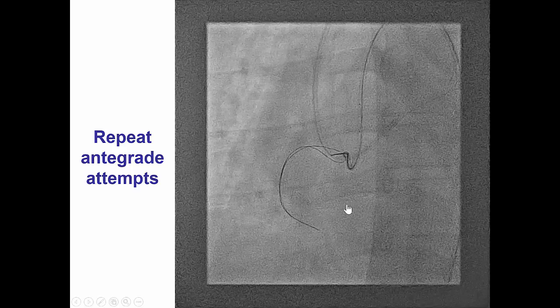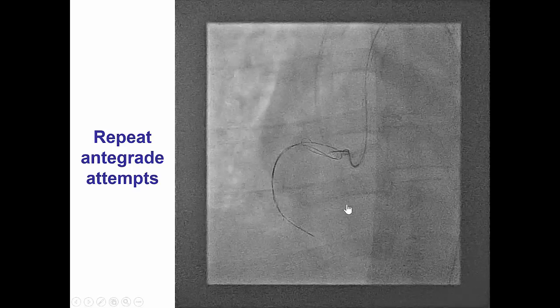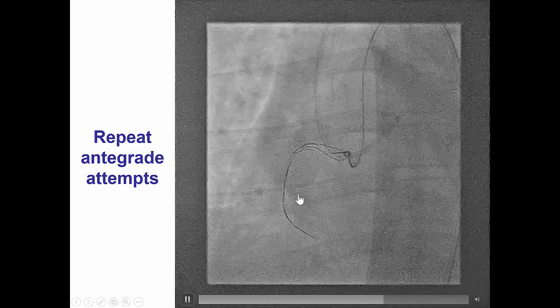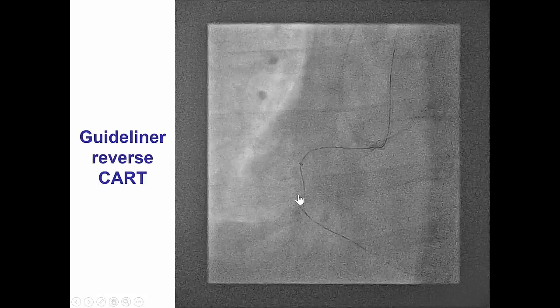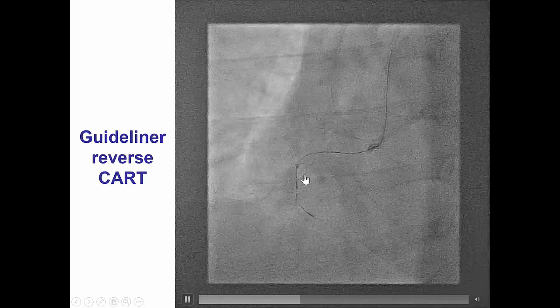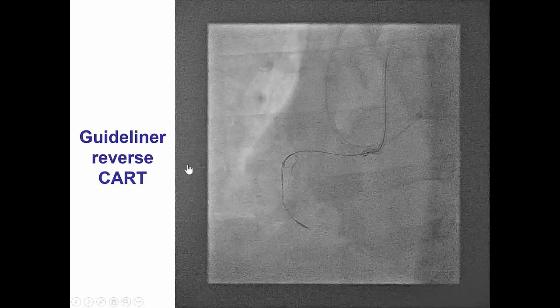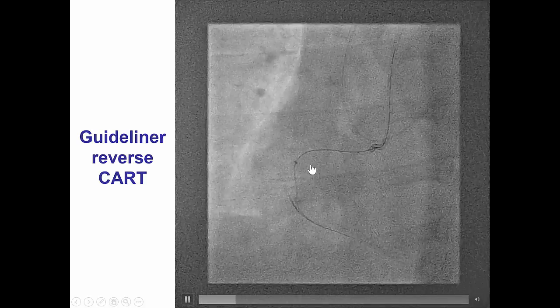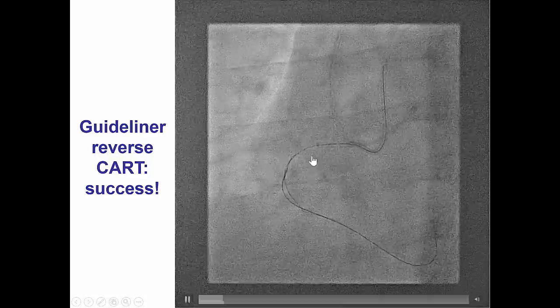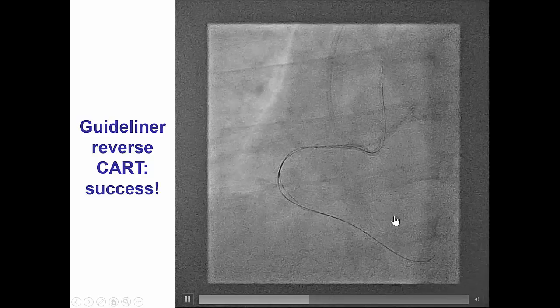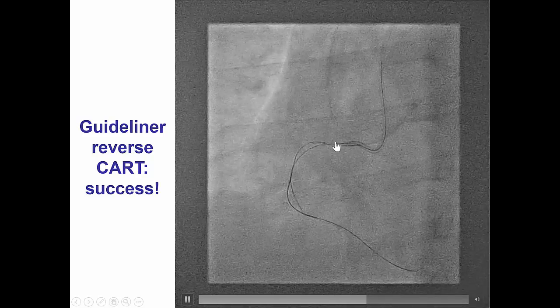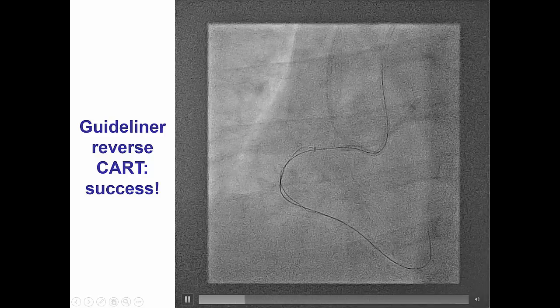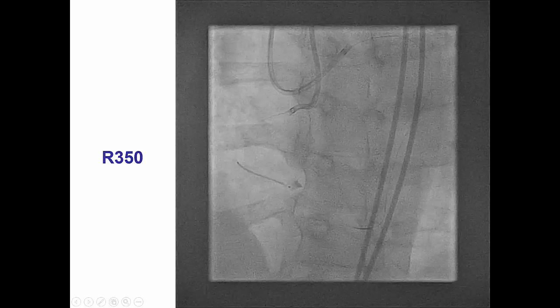We made multiple antegrade attempts to get a wire into the dissection plane, and eventually we were able to advance an antegrade knuckle tracking the retrograde knuckle. We then advanced a GuideLiner catheter to the mid RCA in an attempt to perform the GuideLiner reverse CART technique. However, we were unsuccessful in the mid RCA and had to reposition the GuideLiner in the proximal RCA, where we were able to advance the retrograde wire into the GuideLiner and successfully enter the antegrade guide catheter.